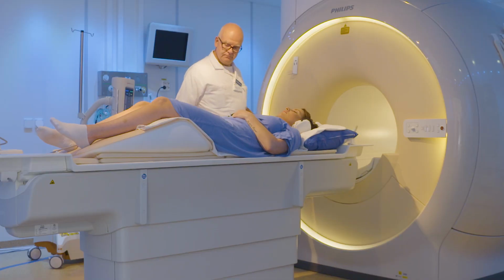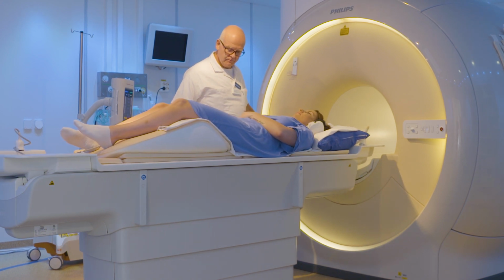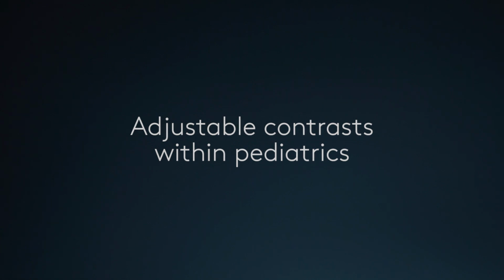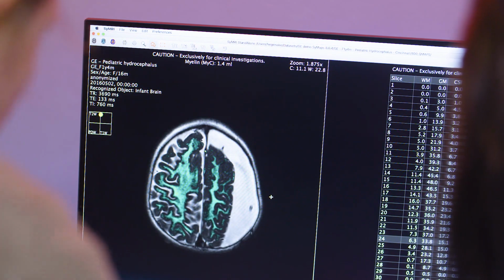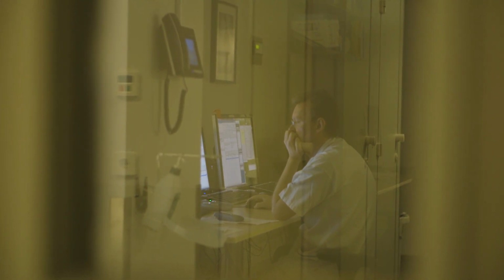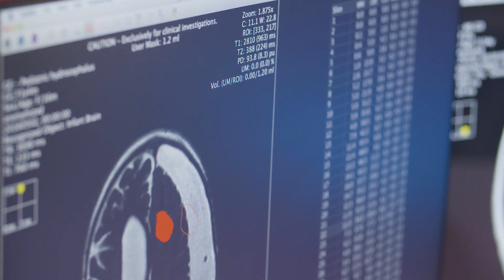And if it falls below or outside this range, this helps in better diagnosis and helps the radiologist prepare and answer the referring doctor accordingly. Especially in children, where the brain is not so mature, the adult or fixed TR and TE values may not apply to a 3-month-old or a 6-month-old or a 1-year-old versus the 18-year-old that we have.